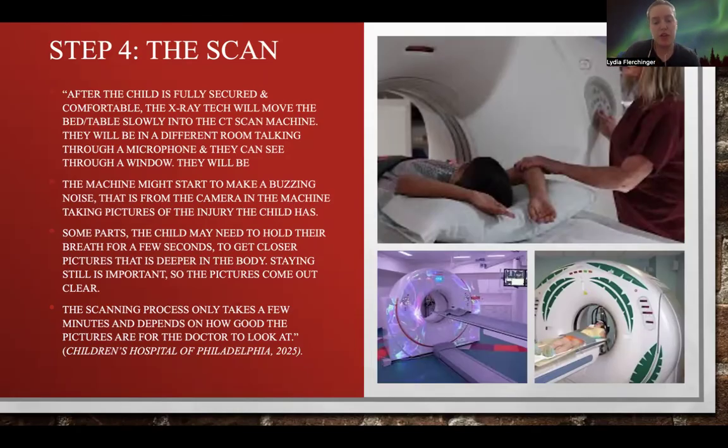You can see in the picture up here, the little boy has his hands up to make sure that he's lying still, so that they can see his whole stomach. And you can see when you're going through the scanner, the scanner will light up in colors.